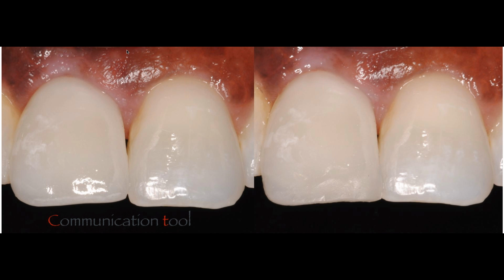How can I use these photos as a communication tool? So I'm going to tell you a little bit about this case. If you look at the photo on the left side of your screen, you will see that I'm restoring a single implant on the anterior segment of this patient, on tooth number 8 to be precise. So we're going to restore tooth number 8, and we have an implant placed. We have a zirconia abutment, and now we have an Emax crown on top of that abutment.